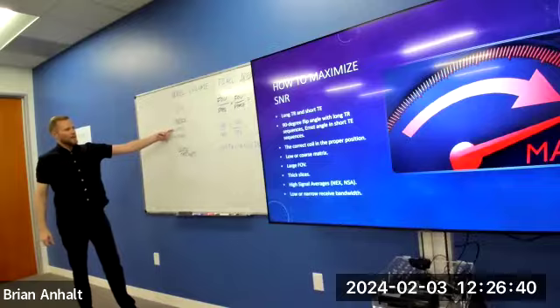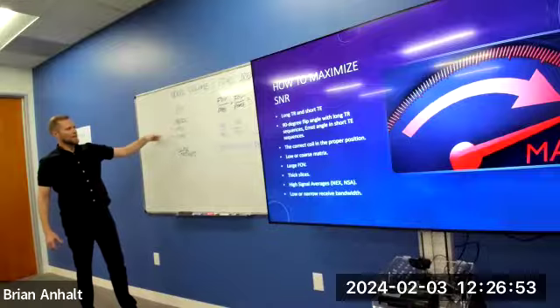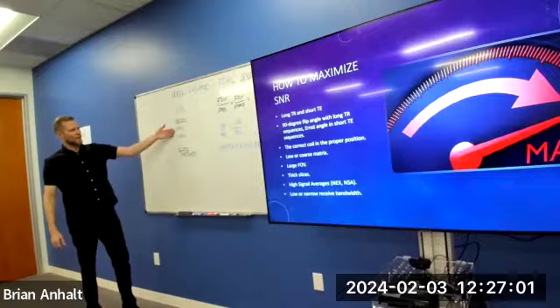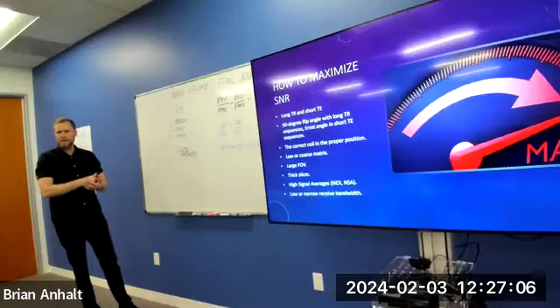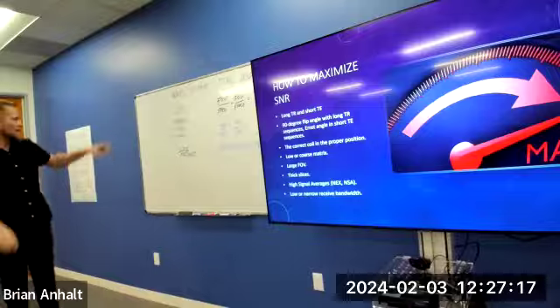The reason we have the matrix divided into 2 pieces called something different has to do with the way we spatially localize. We won't get into that until physics 2, fortunately, because it's a whole other thing. But just know that if I have a field of view, I have 2 different directions, right? I have to cut one of those into a certain amount of pieces and the other into a certain amount. And we call them frequency or phase, and you can swap them. It's up to you as the operator. You just need to know that there's a difference.